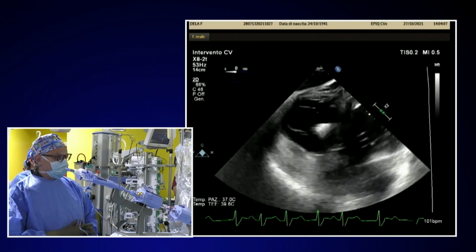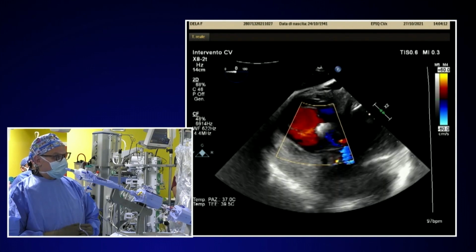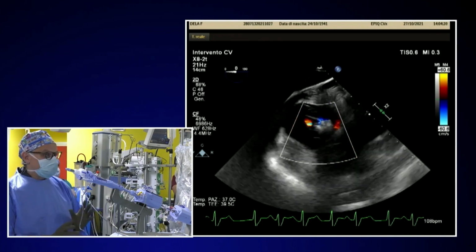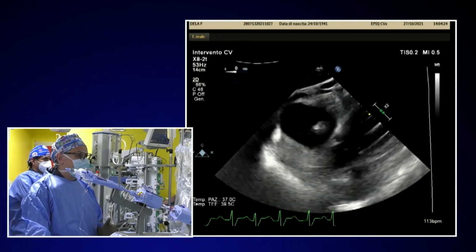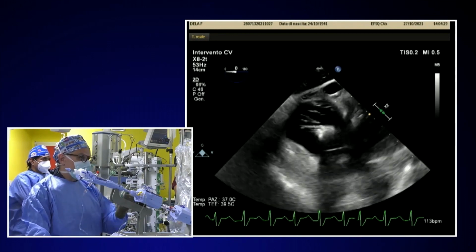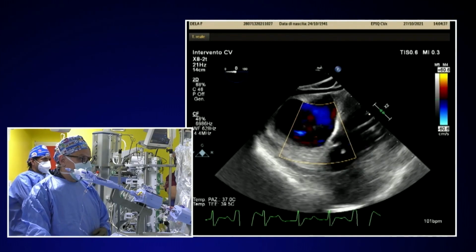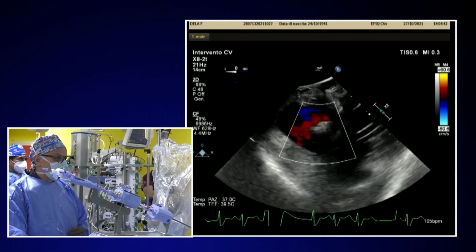And obviously, you have the other component of the anterior leaflet, which is still open, and probably there might be a little bit of jet there. It's not too much, but you see there is a little bit of a jet there. The challenge here is that now we still have 3 leaflets there. It's not one. It's not the typical clover. If we want to do something, we still have 2 leaflets plus, in front of them, the remaining septal. I also think so. I would not touch that area because it's too complicated.